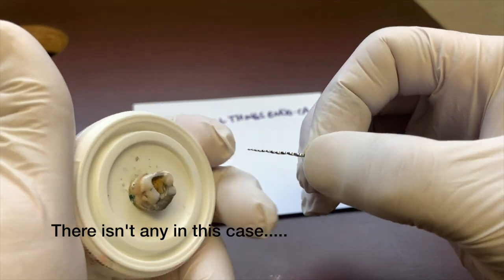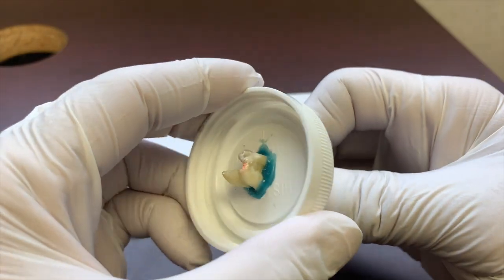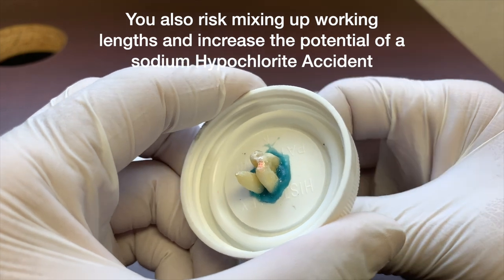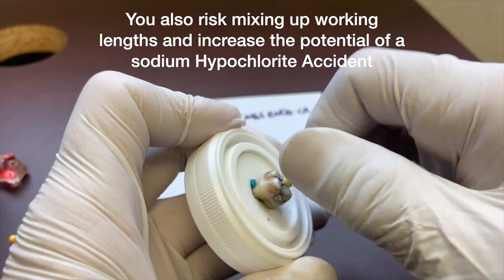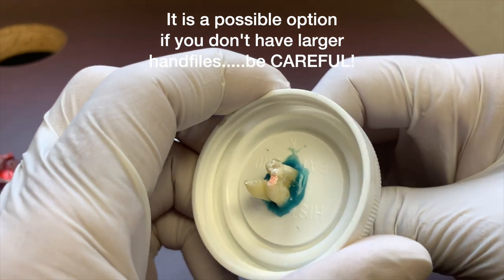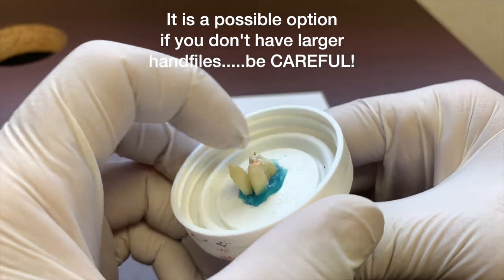Now the problem with that is that obviously you're taking the file into the PDL, or your lesion of endodontic origin area. So that's one problem. The other one that may be problematic is increasing the size, and it's hard to control unless you're a super expert, of which I am not. So to keep things safe, I can't even get this back in. Hold on a sec, there we go. So that's one way to do it.